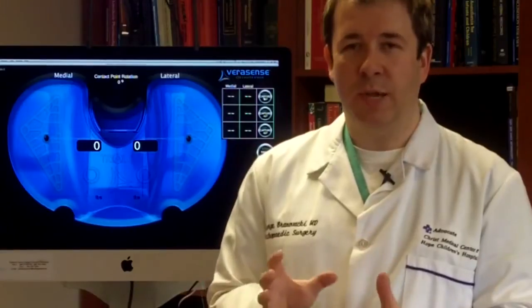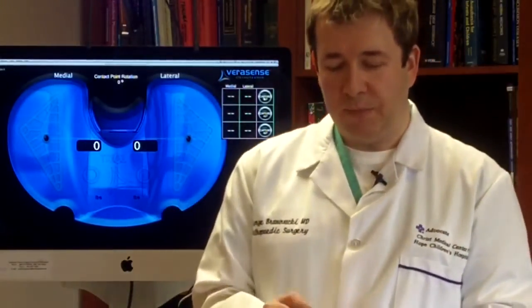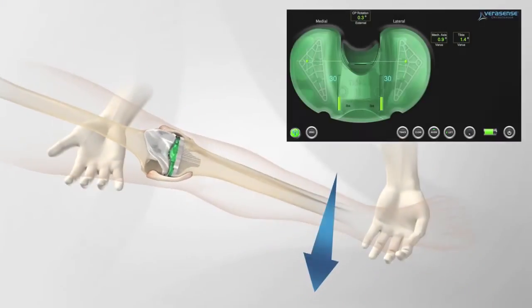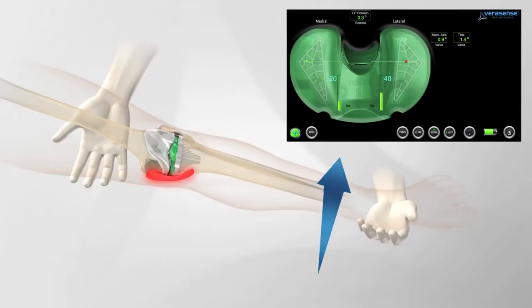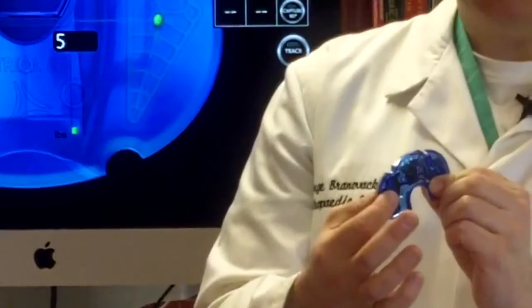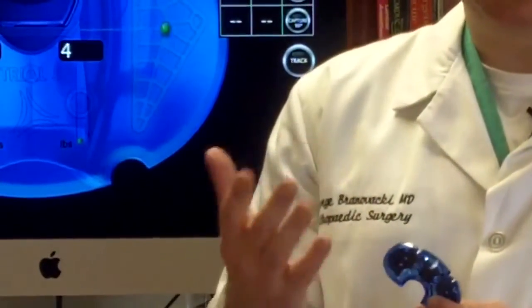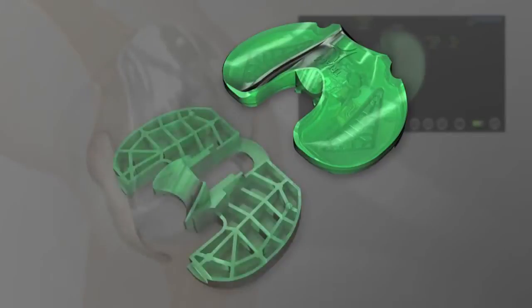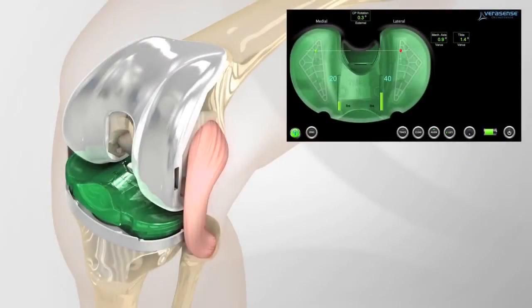Once the implants are in and we're testing to see if we're too tight and too loose, we put in a device which is opened up sterile on the field and is disposable. It has microchips in it, which are sensors that check the pressure in the joint. So if the knee is placed into extension and made straight and there's too much pressure on one side, it'll register on the computer screen. And if there is no pressure on it, that means that the alignment is too loose, and you have to put in a thicker plastic or do some releases and modify your balancing.